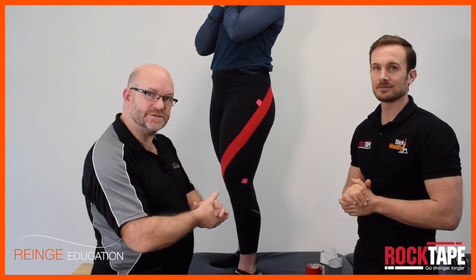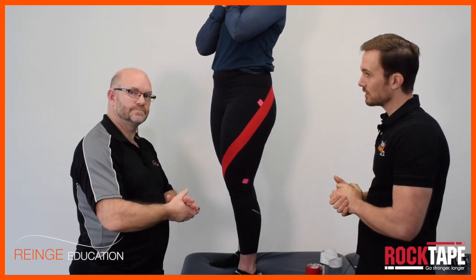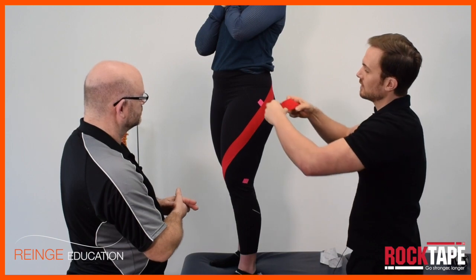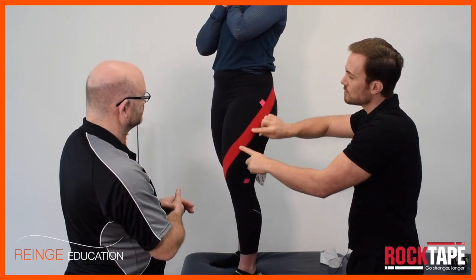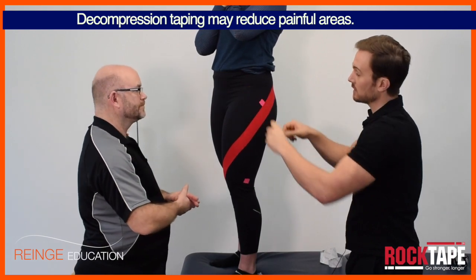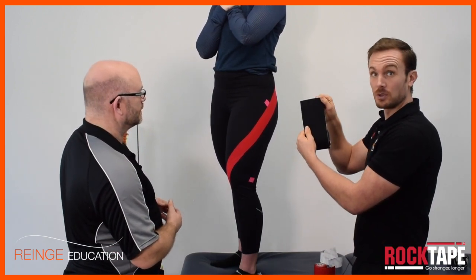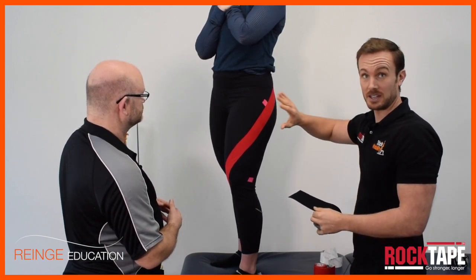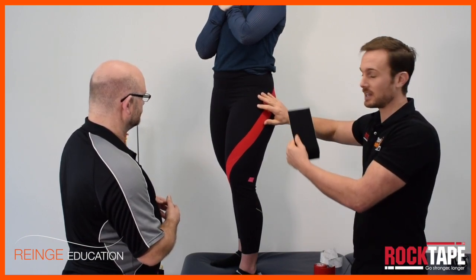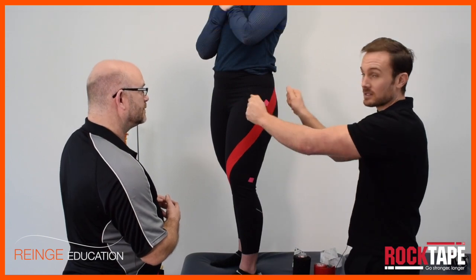If we were dealing with bursitis in the hip, could you put a decompression strip there? Yes — with this technique we're looking at movement, and with a decompression strip over that area we'd be looking at simple pain relief. So we've got a movement re-education taping and a symptom reduction taping — two different types that work well together. If you use the wider 10-centimeter tape over a wider area, you'll get a better decompressive effect. For taping decompressively over the lateral hip, use the wider tape because it grabs more of the soft tissue and creates more of a decompressive effect.